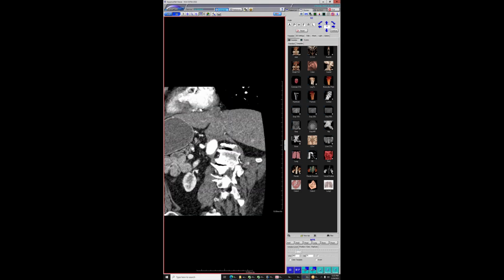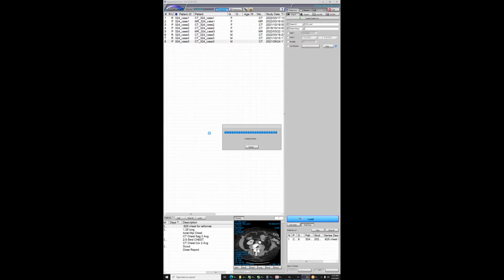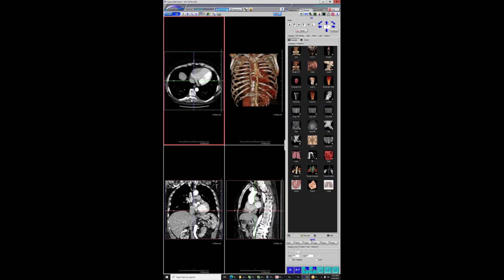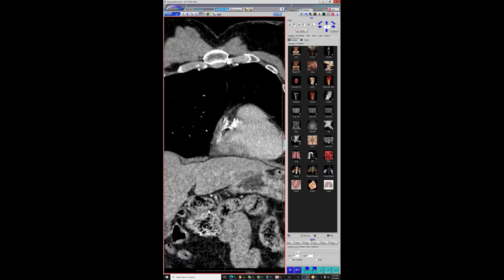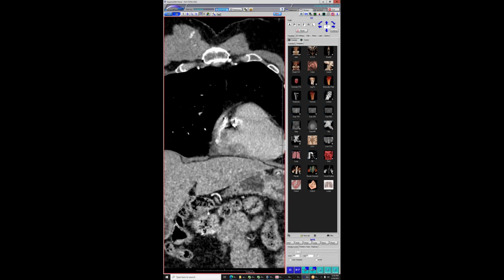But yeah, they're gonna just treat them. I wanted them to get a biopsy so we can definitively see what it was, if it was truly gonna be a Met or something else. But they're gonna just treat him, and he's obviously not doing so well. And you think it's myocardial or pericardial? So, like, where did it start? I think it started, personally, I thought it started in the myocardium, given this. Okay. So it was more severe early on, kind of in that wall here, and then I think it grew out.